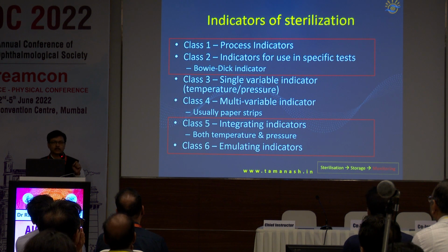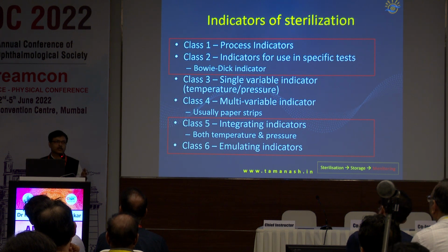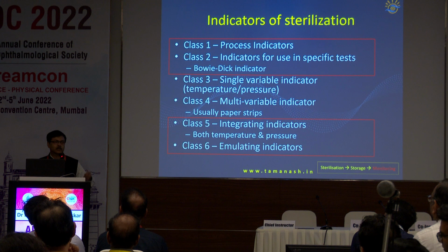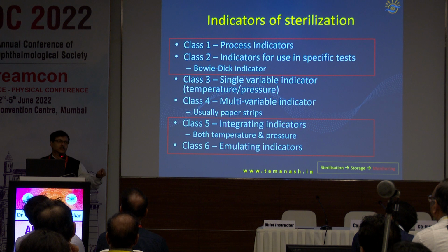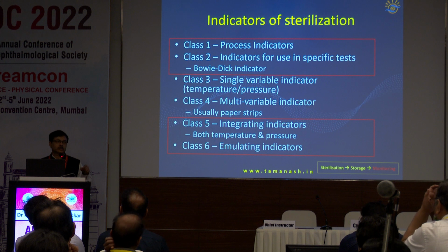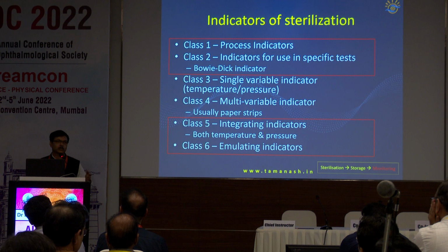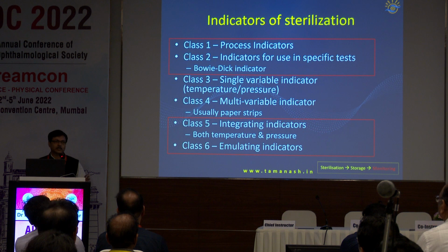I had the experience of a drum which was not put in the autoclave at all, and the OT technician thought he would get a scolding, so he came and opened the completely unautoclaved drum. But incidentally, the OT sister, as per protocol, was vigilant, and she saw that the strip inside had not changed color, and he was caught immediately. These things happen because, as Anshuman was saying, we should not browbeat our staff, because then they will try to hide facts. The entire OT system is based on trust and trust and trust.